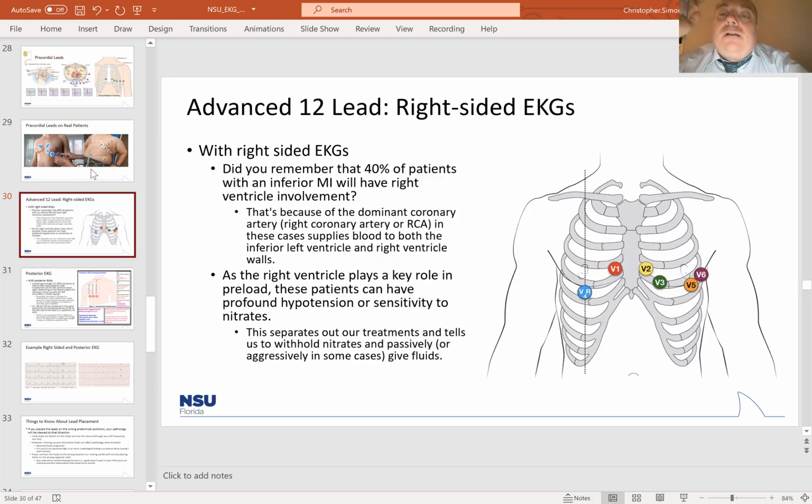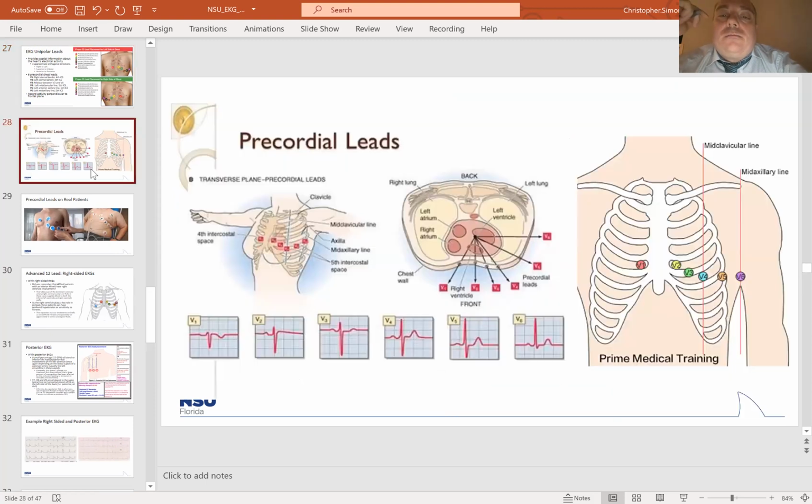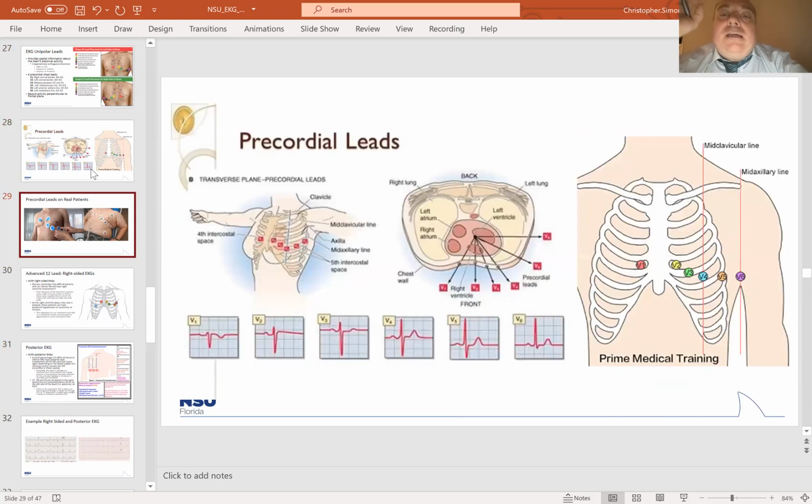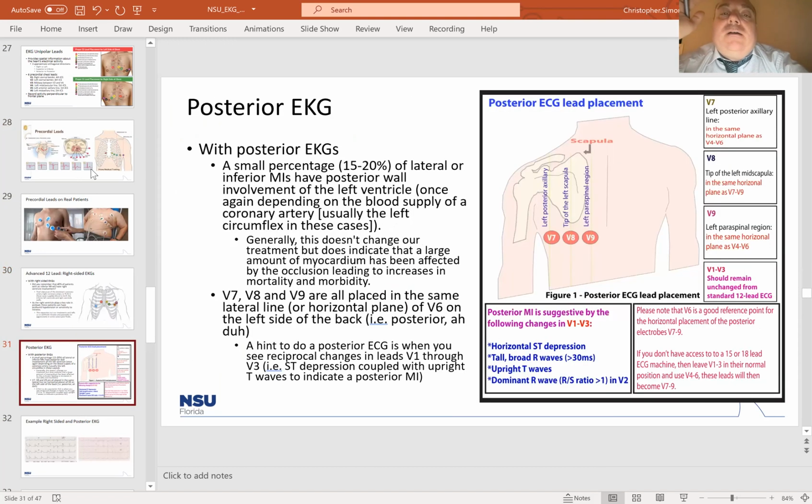But if I have a clinical suspicion based on EKG findings that warrant investigation of the posterior wall, then I absolutely will do a V7, 8, 9 just to see what's going on. So for right now, we're not to the point yet where we're diagnosing MIs and looking for myocardial ischemia and an infarction. We're not there yet. Okay, so don't worry about that just yet. Just know where they go for now, and why would I want to do it? Because I have clinical suspicion that needs to be done. Okay, so that's pretty much where we're at right now for that.